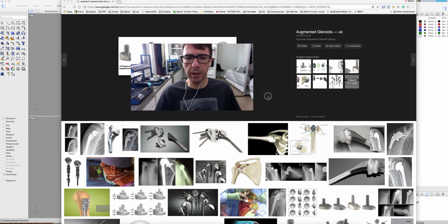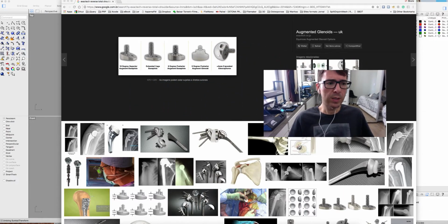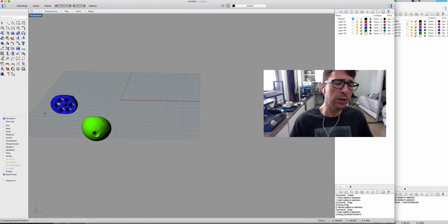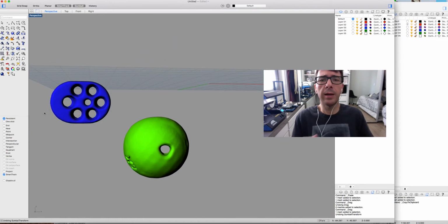We can do just drawing, but I'm going to show in this video how we can use the implant as reference. So you can see here, these are the implants we have created from the CT scan. We have many videos on our platform in Udemy showing how we can create a 3D file from a CT scan using Horos, InVesalius, and many other software.